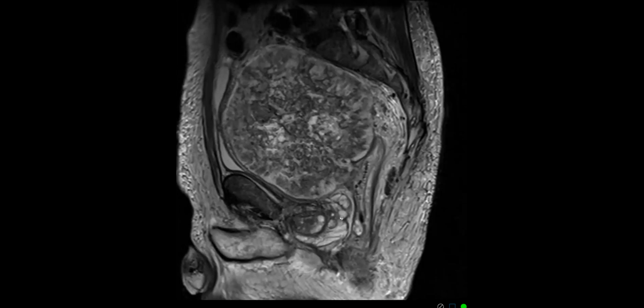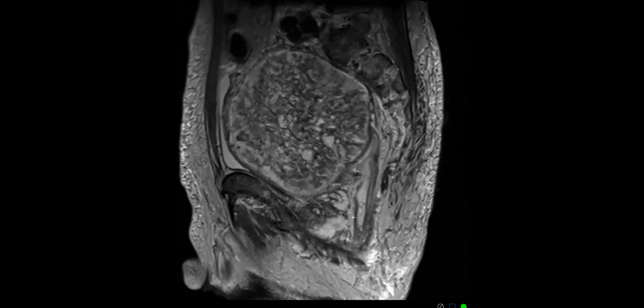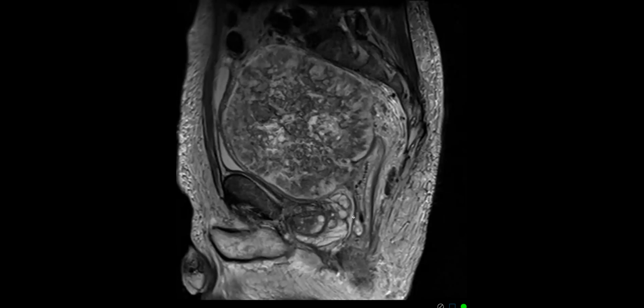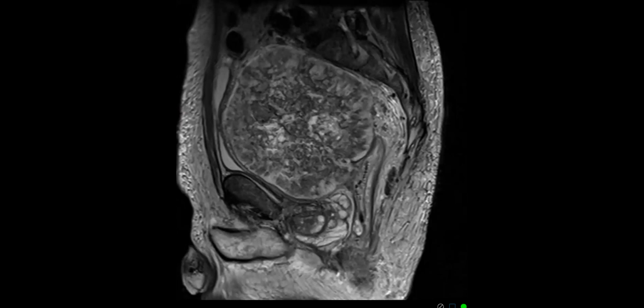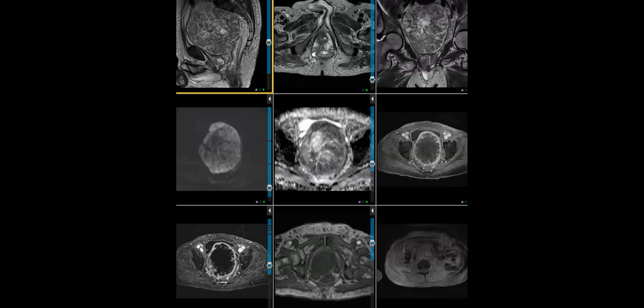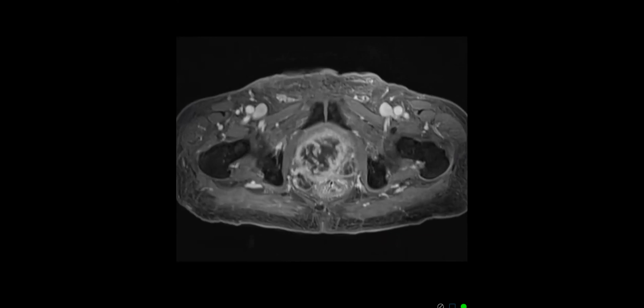And I don't think it's a rectal GIST. Why do you say that? I contemplated it, but I feel like the T2 looks different to me than most GISTs. Yeah, it's too heterogeneous, right? I guess they can undergo necrosis and look like that. It can definitely have central necrosis, but something about the inside of it doesn't look like a GIST to me, but I would look to see if I could see it connected to the rectum.